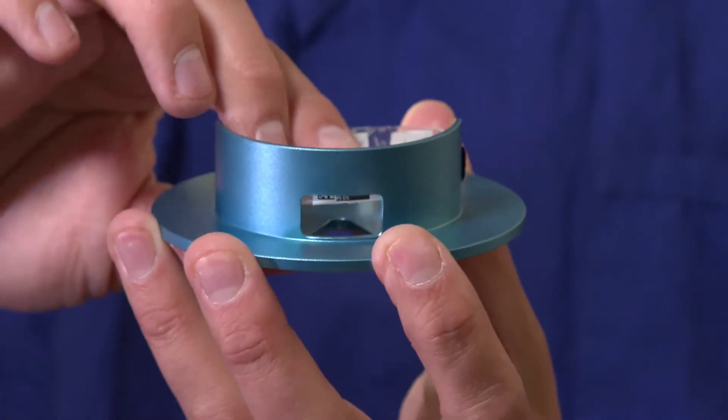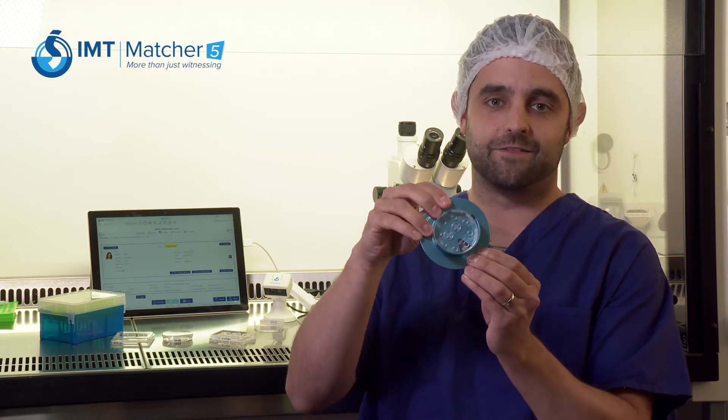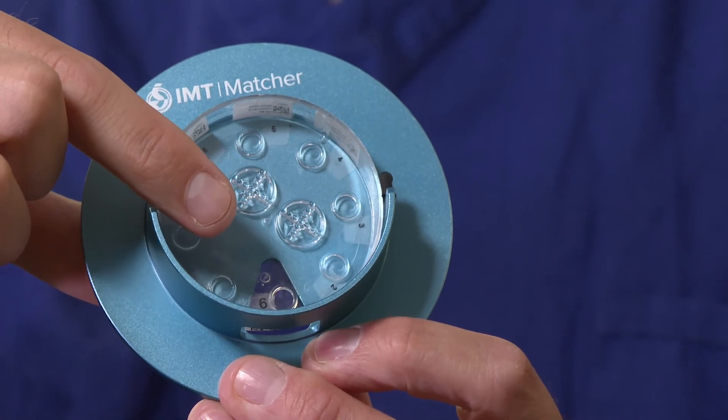The Active Well Selector allows the user to isolate a single barcode through the active window, and the keyhole in the base of the selector allows only the corresponding well to be seen through the microscope, ensuring the correct embryo is selected, witnessed, and recorded in Matcha.